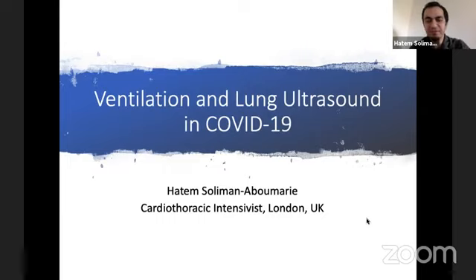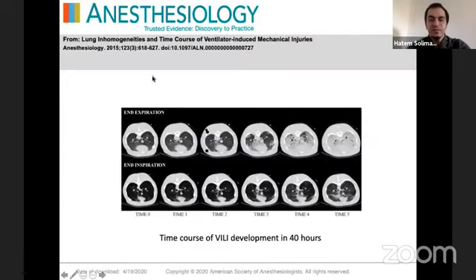I have a very brief presentation on the use of ventilation and lung ultrasound in COVID-19 patients. So moving on to my presentation, I would like, in the beginning, to highlight probably one key message. If I want to summarize the whole idea of my presentation from what we saw in these patients so far, it is that we need to be patient with them and we need to give them time on the ventilator if we decide that they will need to be on mechanical ventilation.